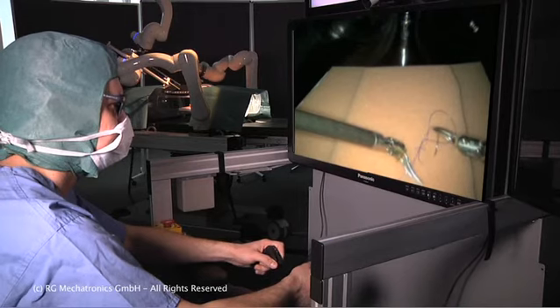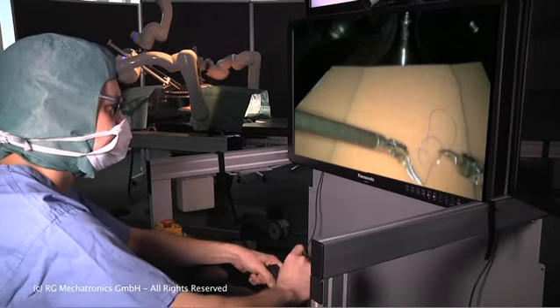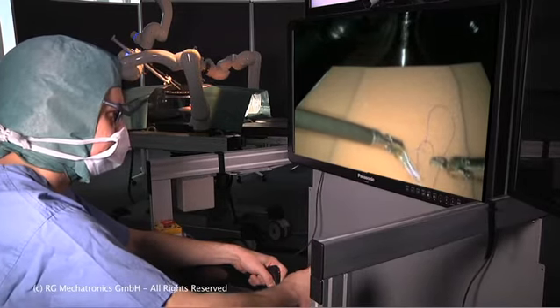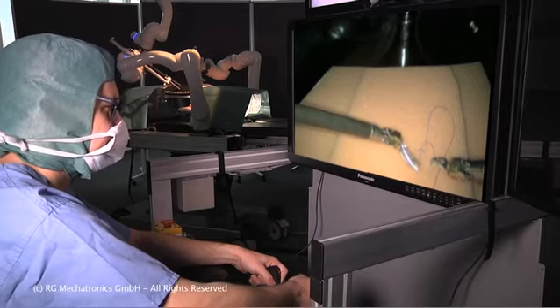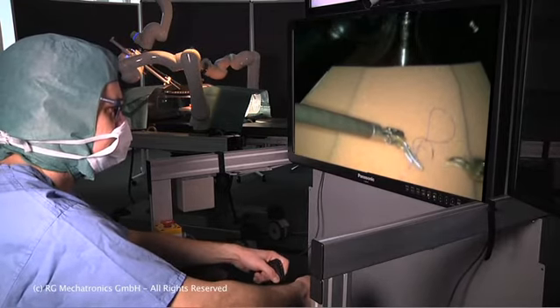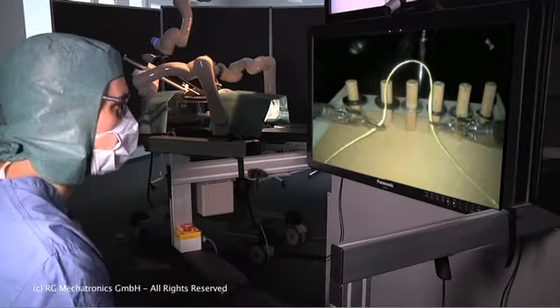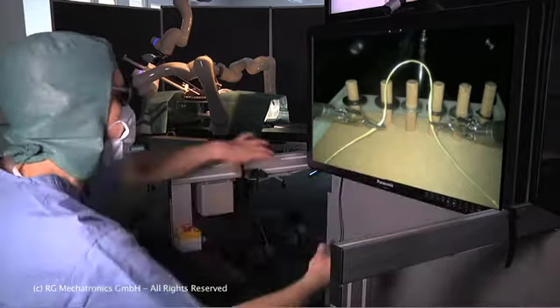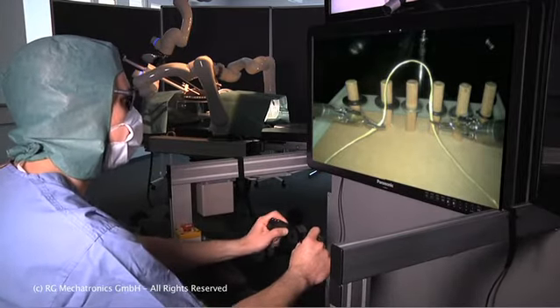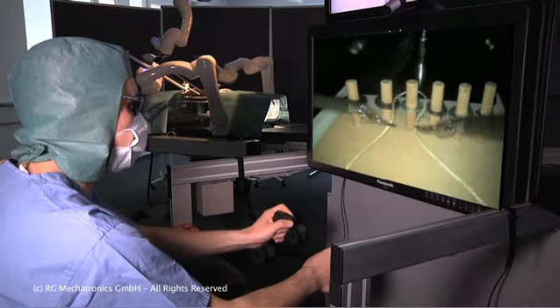And our trainee surgeon has almost managed to tie a knot. Here we can see the input devices are stored and now picked up by the surgeon, who aligns them quickly and can proceed with the operation.